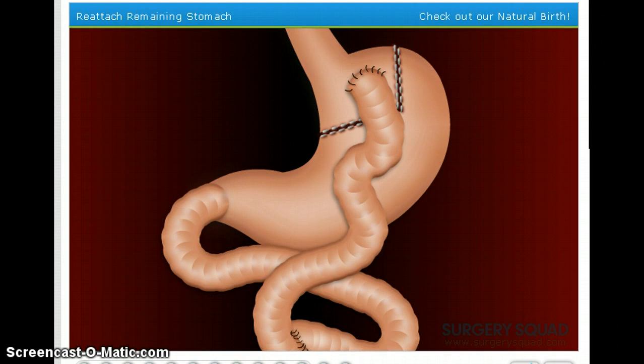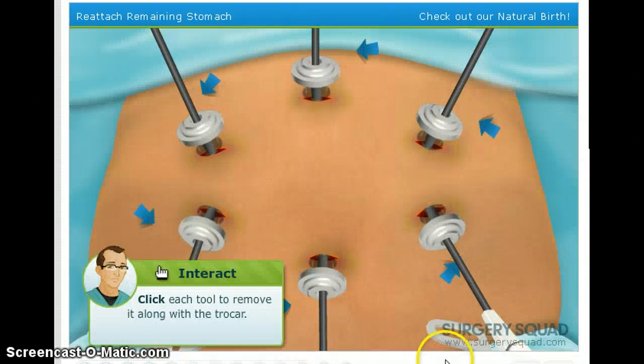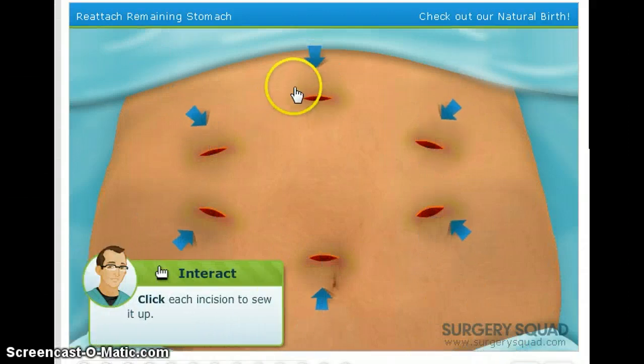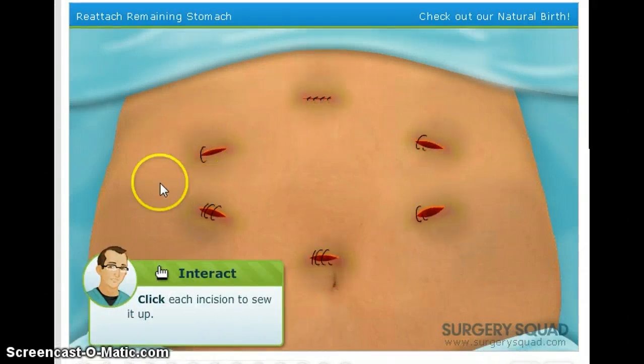The new smaller stomach pouch was created. Everything has been reattached, and we checked for any leaks in the sutures. This new configuration allows our patient to feel full sooner when eating, but also lets the fluids from their original stomach aid in the digestive process. I'll need you to remove each of the laparoscopic instruments and trocars. Now we need to suture each of the incisions. Nice work. I bet that won't even leave a scar.